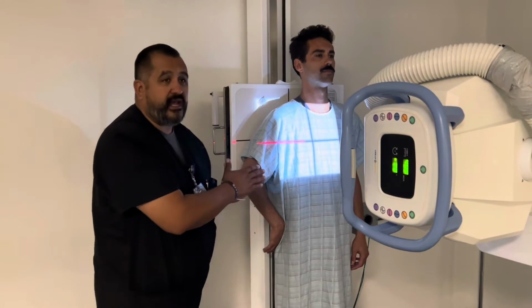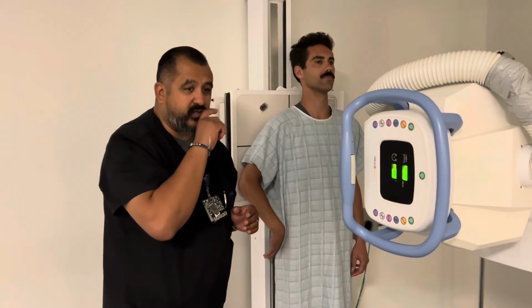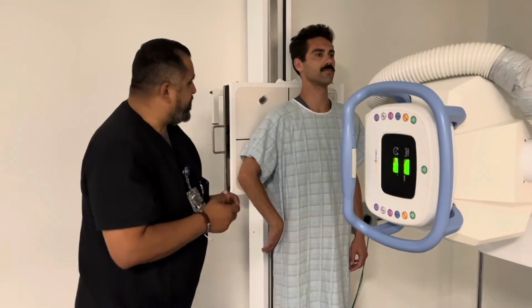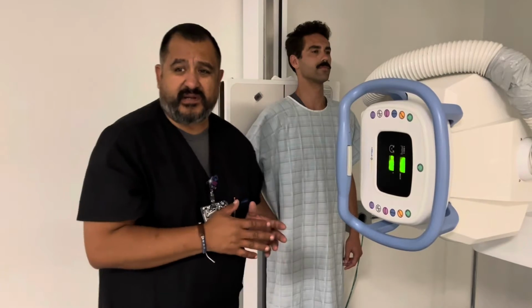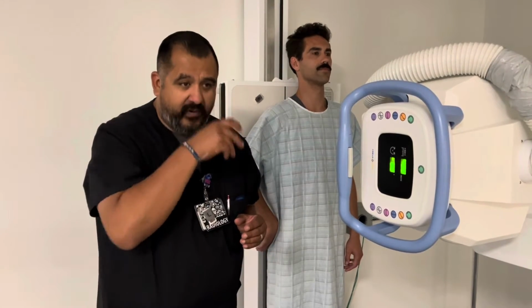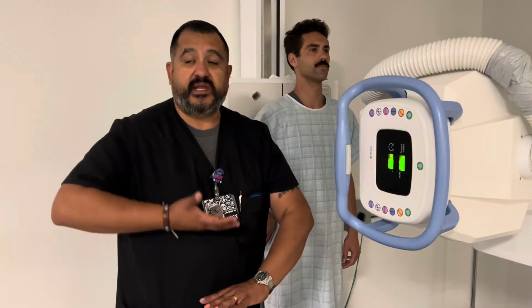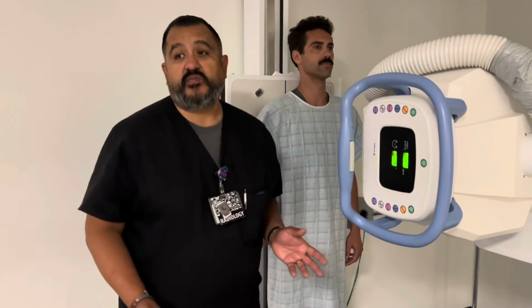I have the technique set at 12.5 mAs at 74 kV. He's pretty thin, so I probably would go down to maybe about 10 mAs at about 74 kV. Since it's above the diaphragm, I want the diaphragm to go down to its lowest position, so I can get as many upper ribs as I can. We always want to shield the patient.